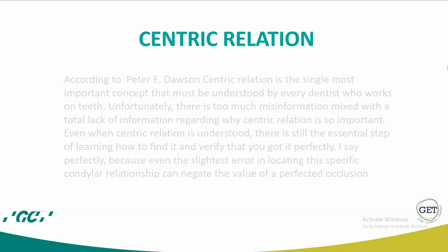Even when centric relation is understood, there is still the essential step of learning how to find it and verify that you got it perfectly. I say perfectly because even the slightest error in locating the specific condyle relationship can negate the value of a perfect occlusion.